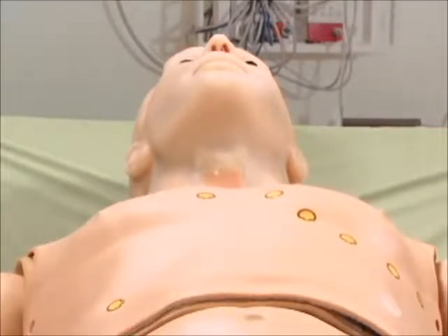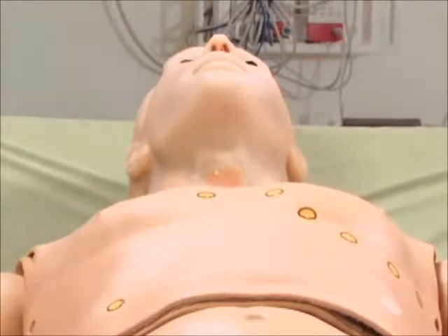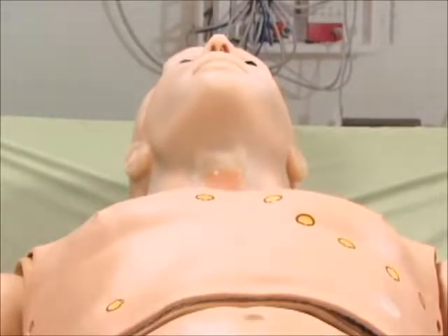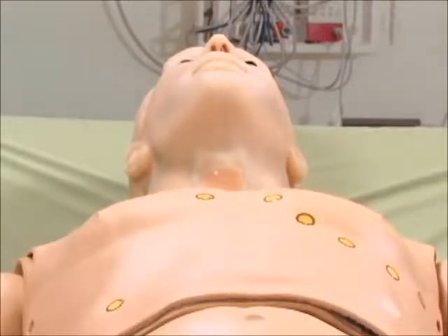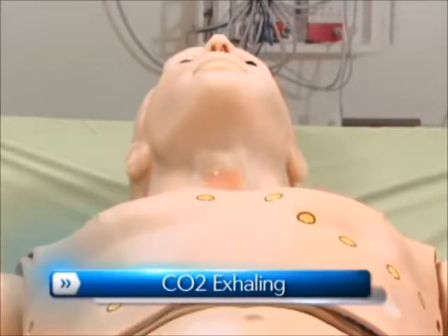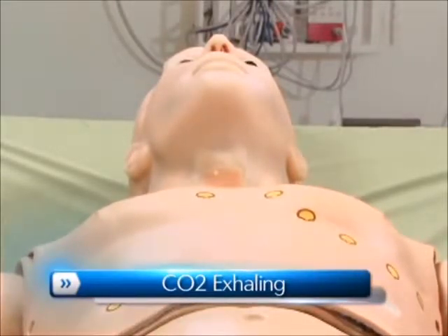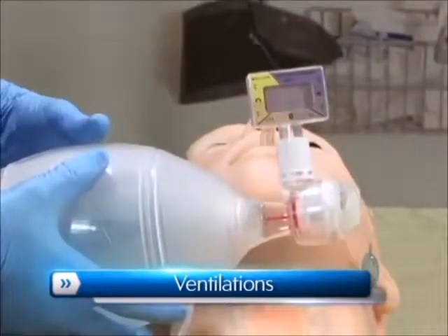Proper intubation is extremely important for adequate lung ventilation. This simulator is equipped with the ability to exhale carbon dioxide with each breathing cycle. This will allow providers to use colorimetric devices like the EasyCap 2 CO2 detector, providing visual feedback about proper placement of an endotracheal tube. HAL accommodates assisted ventilation, including BVM and mechanical support.